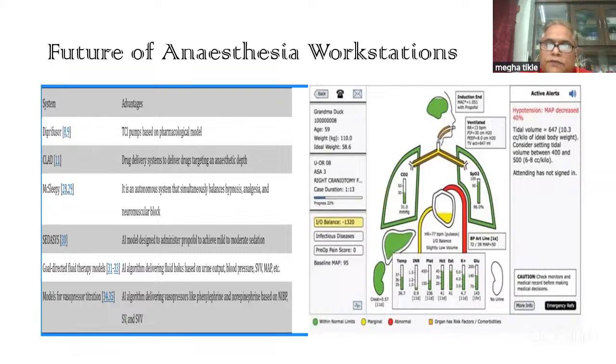Understanding that all mechanisms are not fail-safe. So if you still have a hypoxic gas mixture, basically a crossover or something has happened. So you need to fall back on your emergency cylinders. You need to check your cylinders every day. You need to check their pressures. Are they adequate? For what time would they be there?